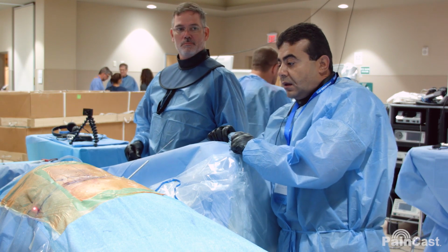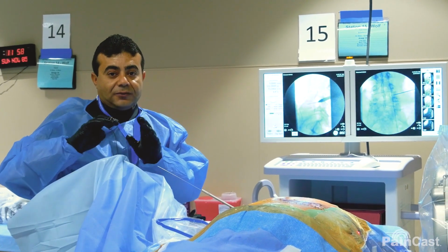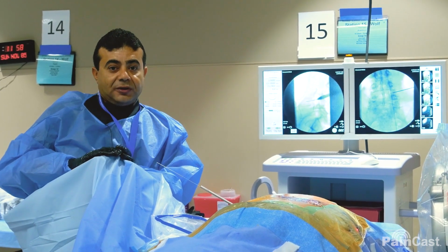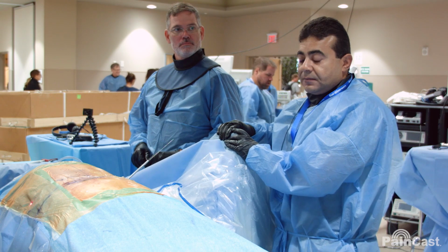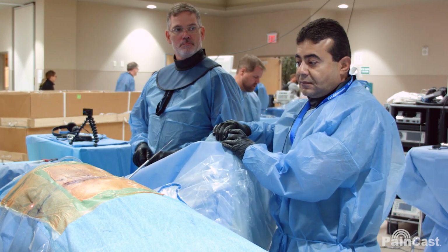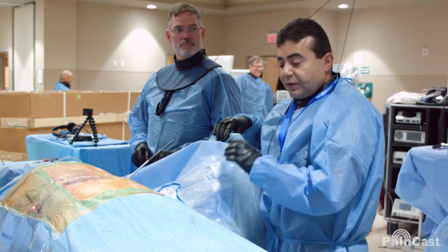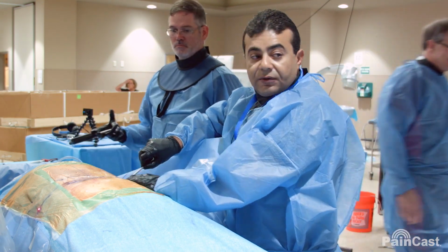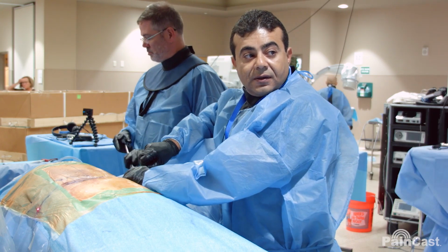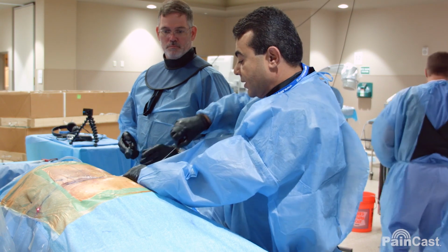So one of the basics is you've got to square off the end plates. In any endoscopic procedure you do, square off the end plates. Perfect. So now we feel how the trajectory is. We're away from any nerve. X-ray. X-ray again. Okay. So that is my entrance.